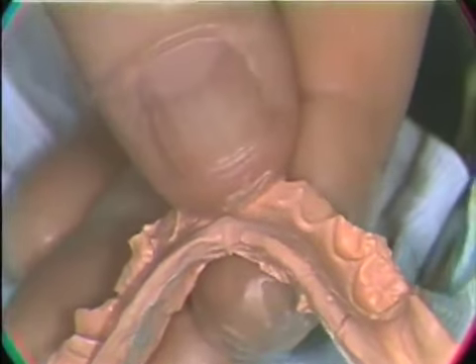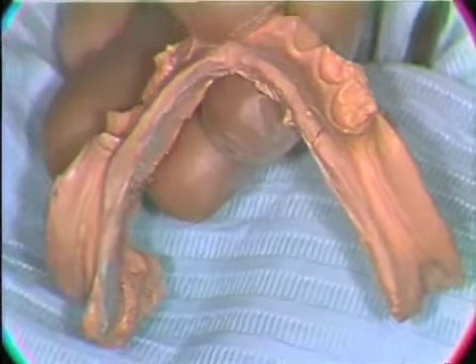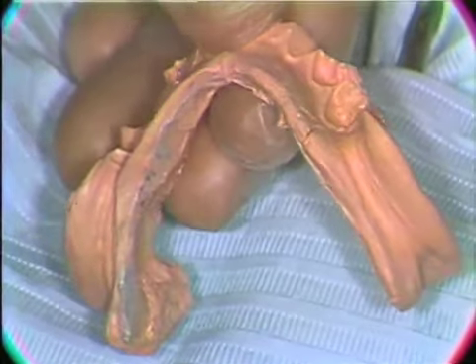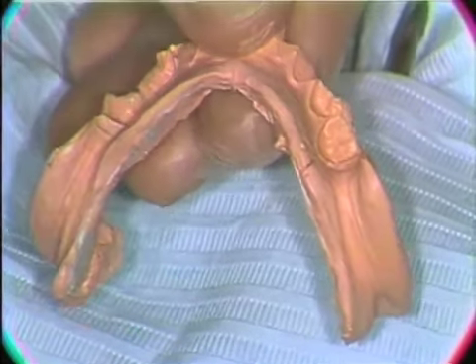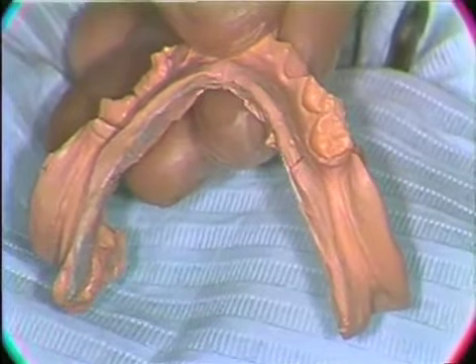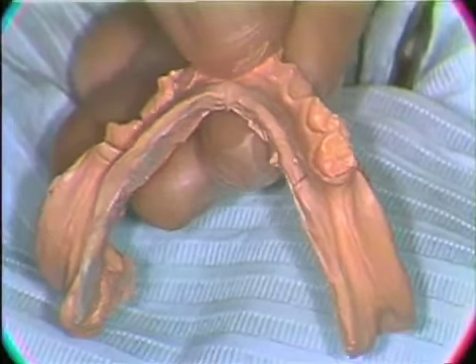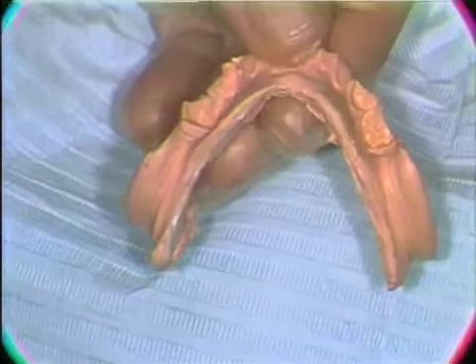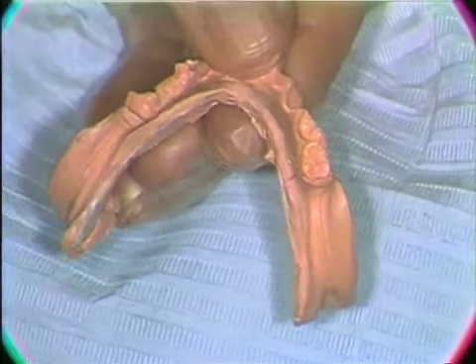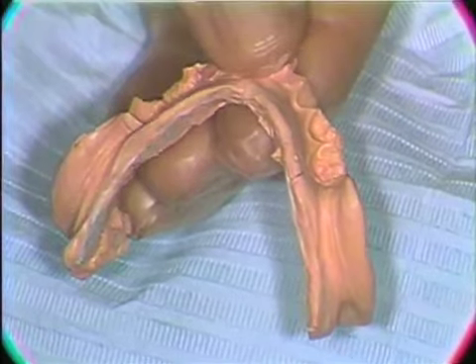I would suggest that when you're taking these impressions, it might be well to have a couple of trays, or as we're going to do in this, it's not a perfect impression, but we're very close. What I'm going to do is go ahead and pour this up and then take another impression. You want to save the impression, one where you get quite close, because you may not get that close again. So I'm going to go ahead and pour this impression up and take another impression.